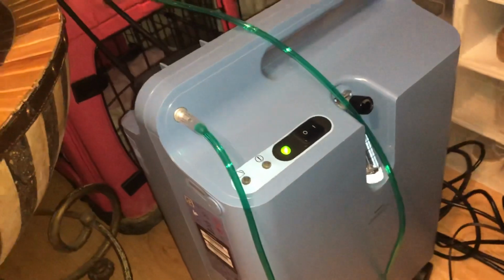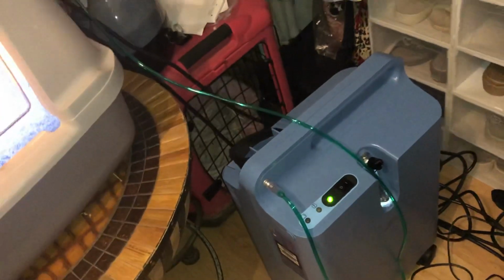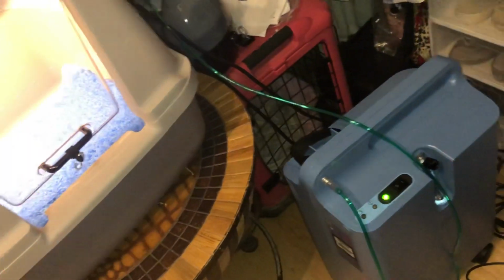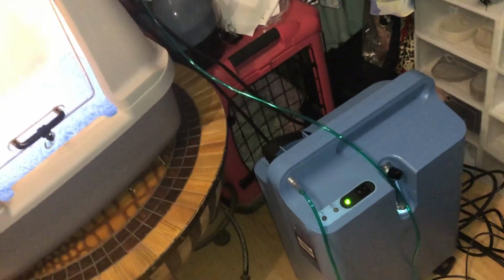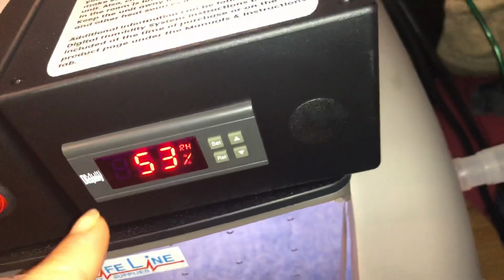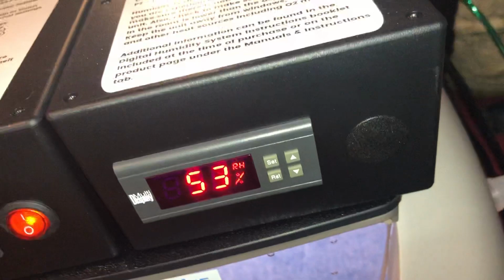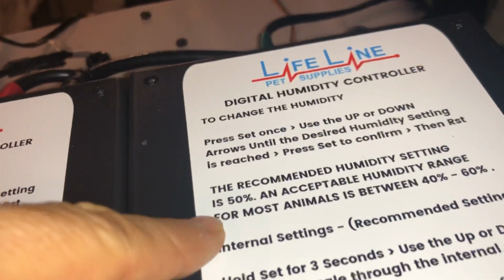It's a little loud, but I've got my little bed over here for when I have puppy problems. I sleep in here because I want to be around my puppies. I'm really hands-on. So I don't know how it's going to be when I try to sleep, but I'll see. But you can hear it. It is a little loud. Kind of like a fan, maybe. And then over here is the humidifier. And the humidifier, you want to keep it around 50% or so. It says here, the recommended humidity settings is 50%.